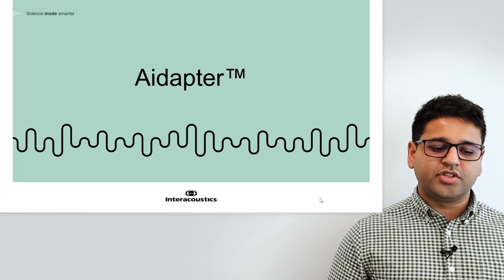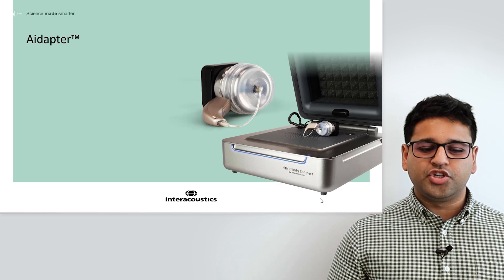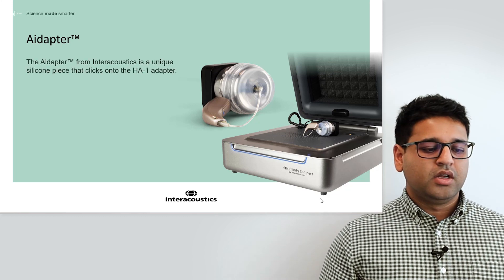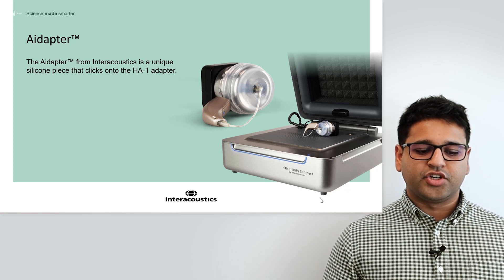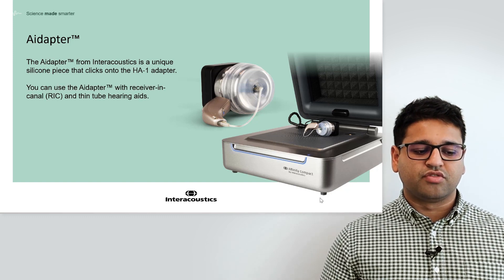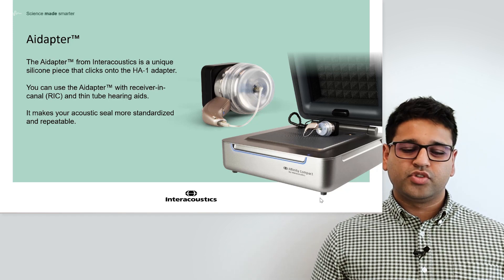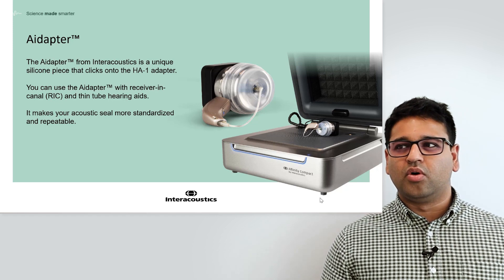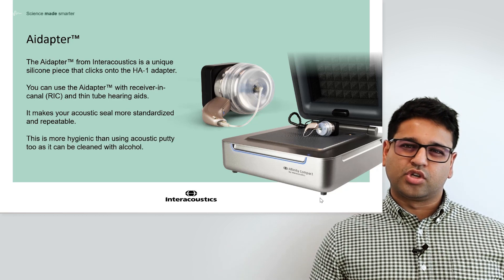Let's begin with the Adapter. This is a new hardware technology to help you couple thin tube hearing aid style devices or receiver-in-the-canal type devices onto the Coupler. It's a small, unique silicone piece that attaches onto the HA1 adapter, as you can see in this image here. You can use this for receiver-in-the-canal and thin tube hearing aids, and it helps to standardise your acoustic seal, connecting these devices to the Coupler in a more uniform and repeatable manner, removing the need to use acoustic putty or glue tag.